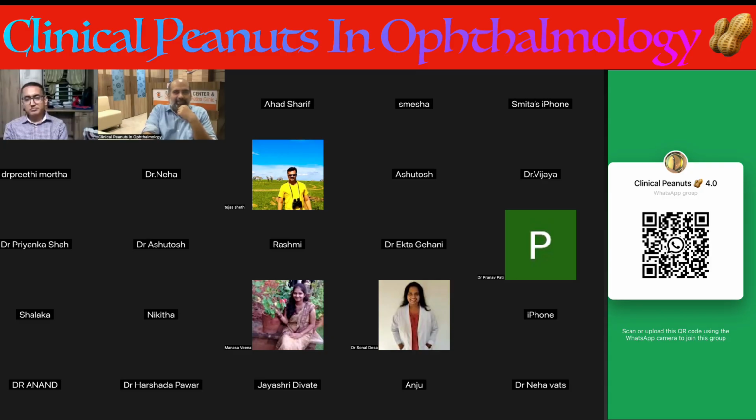Okay. So is there anything like a good cylinder which can be beneficial to the patient? My view on this is that if the patients are having more than 6, many times the vision is slightly less than normal. They usually land up with full refraction coming to around 6/18 or 6/12. So even if you leave some amount of astigmatism and correct 6 or less than 6, that would also justify your surgery.